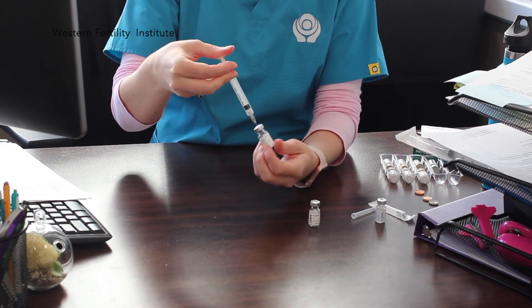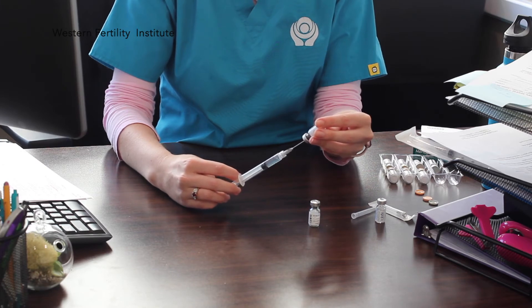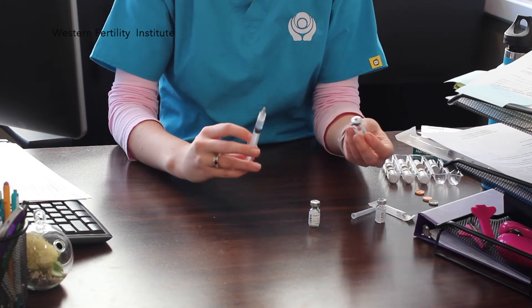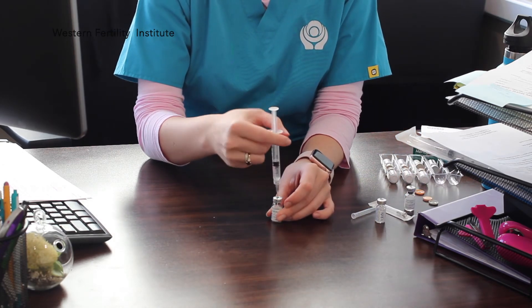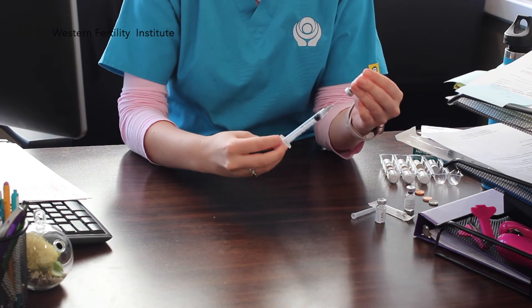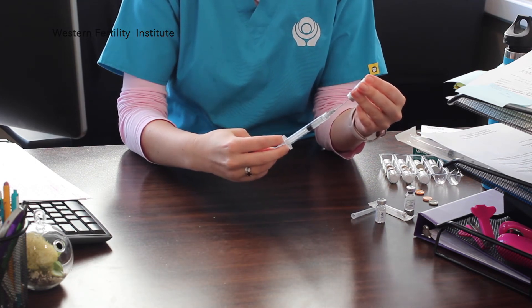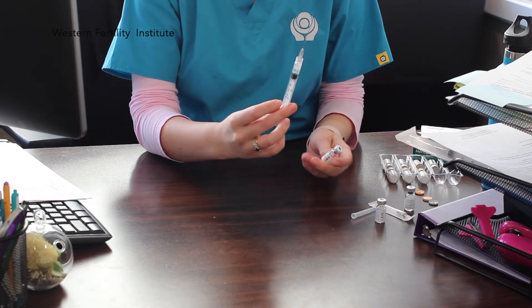Now the powder has turned to a liquid. Draw all that up — it should measure 1cc. Perfect. Then I'm going to put it into the second powder and draw that back up. It should be exactly at 1cc.